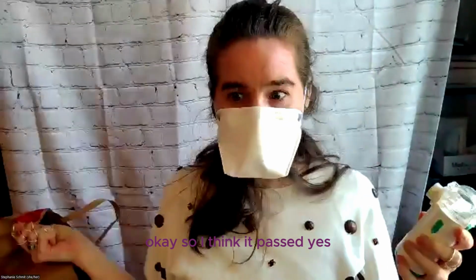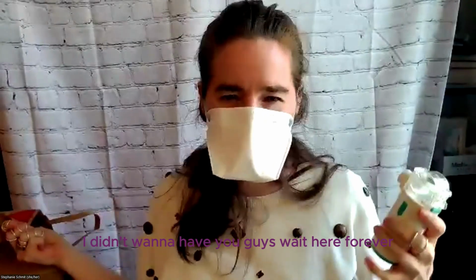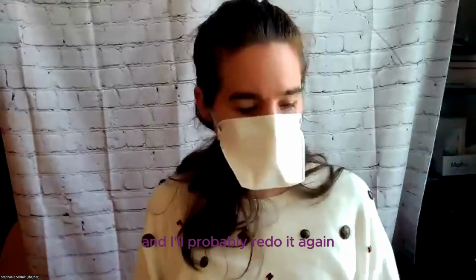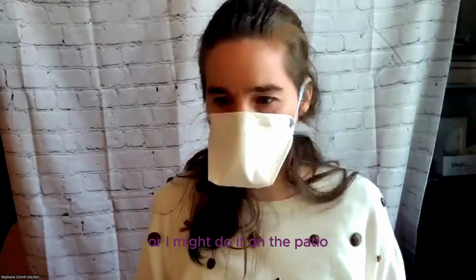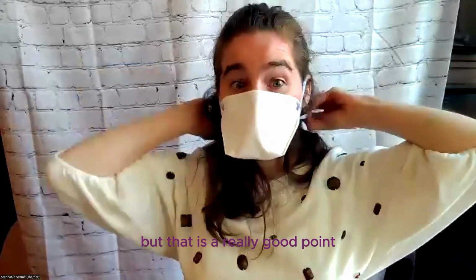Okay, so I think it passed. Yes, you do all the breathing things, each for 60 seconds. I didn't want to have you guys wait here forever, so I did them for however long I did them for. And I'll probably redo it again with the bitter solution when I am going to be out of my apartment, or I might do it on the patio because I don't like it when the bitter is in there. You don't need to do it indoors, but that is a really good point.